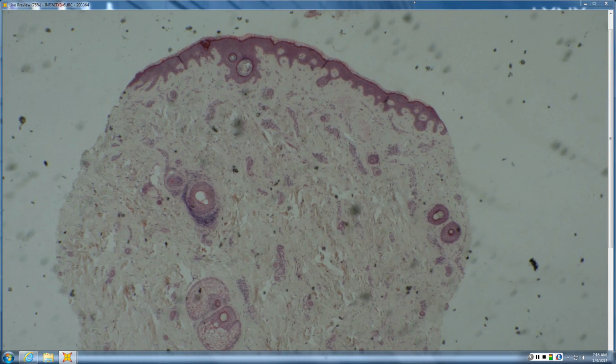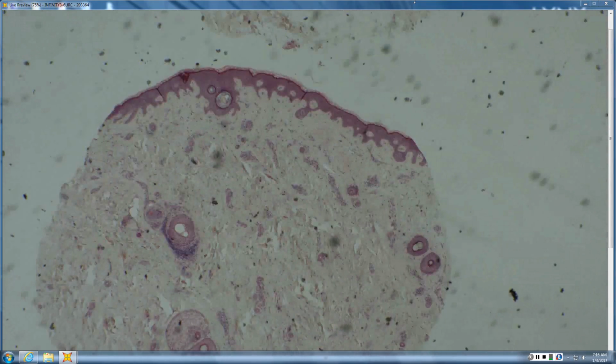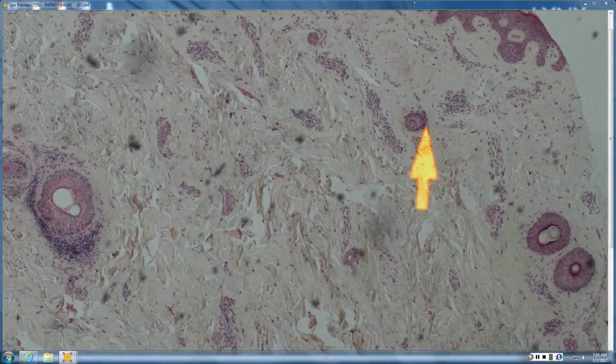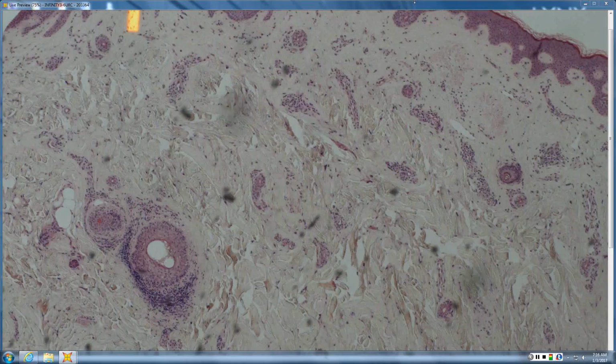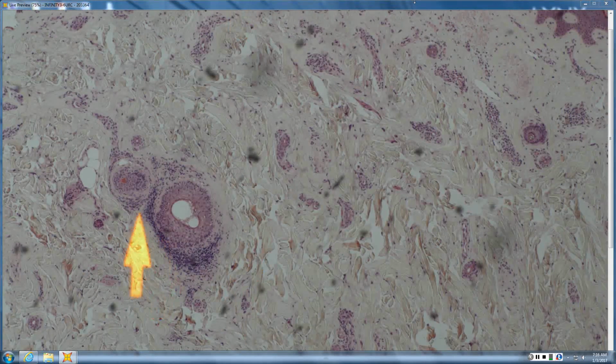Certainly there appears to be some follicular miniaturization and transition to predominantly vellus hairs, because maybe that's what all these little guys are. And then maybe in a person who had pattern alopecia, then they got lichen planopilaris, and maybe that explains some of this lichenoid follicular interface damage that's occurring here.